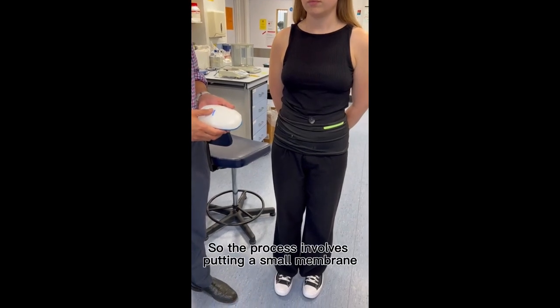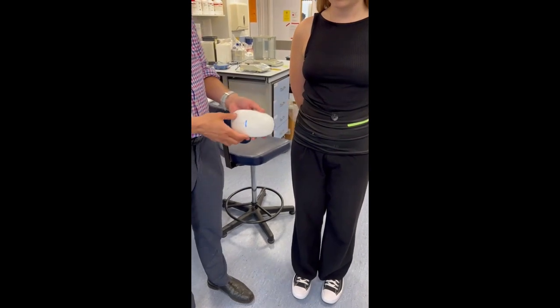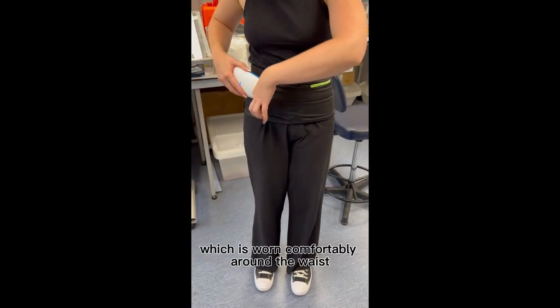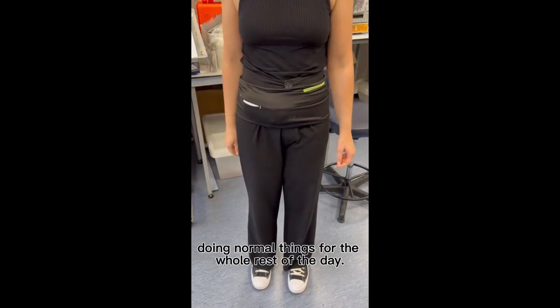The process involves putting a small membrane underneath the skin in a simple outpatient procedure. The device then gets put into this stretchy waistband, which is worn comfortably around the waist, allowing the person to just carry on doing normal things for the whole rest of the day.